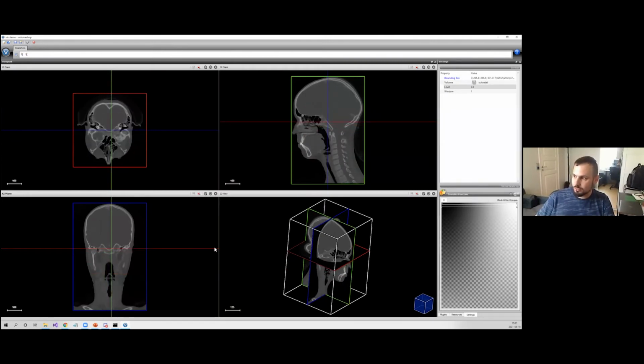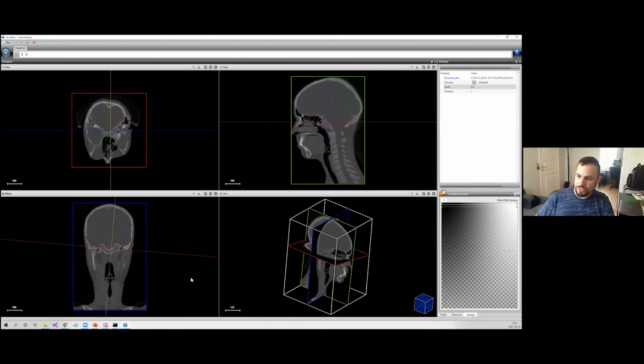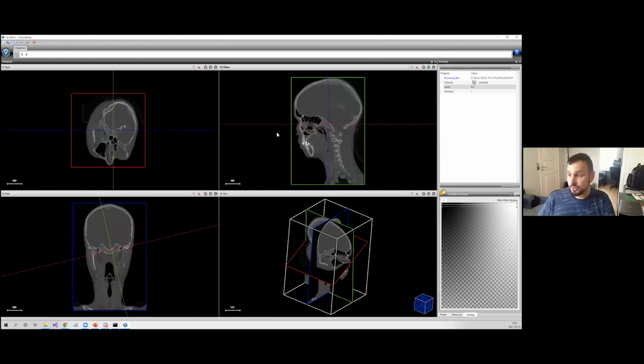And now I can also, for instance, change the orientation of the slices, and it's usually enforced that this slice still stays orthogonal to my original slice. And I can drag here, for instance, to change the position of the slice. So this is a very useful and common tool for investigating volume data.